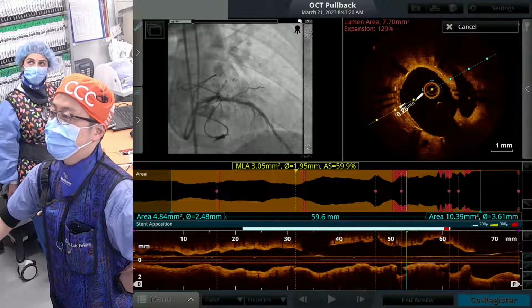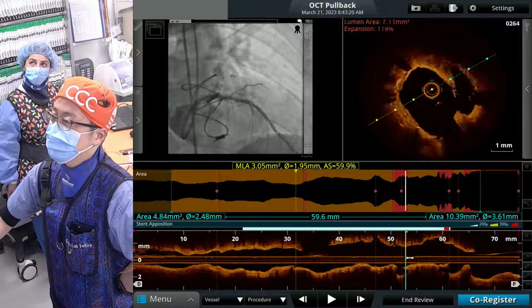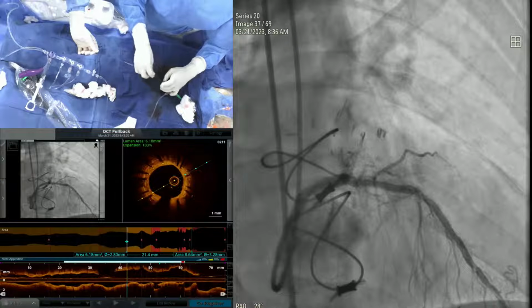Yeah, definitely the stent is expanded. Because pre it was crushed, 1.5, but now expanded to 2.5 at 6 atmospheres. It worked. I think we should have just done IVL rather than that. The carina which we had, has that been pushed on one side now? No, we could do more.